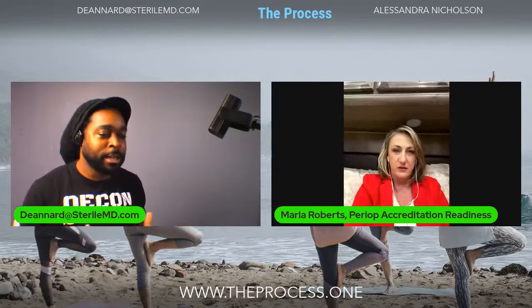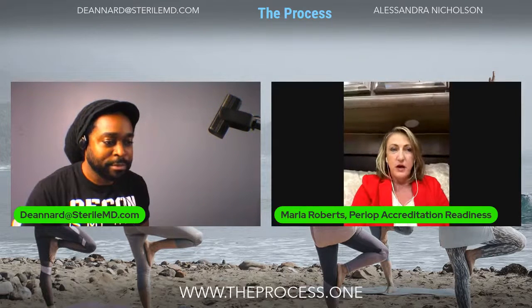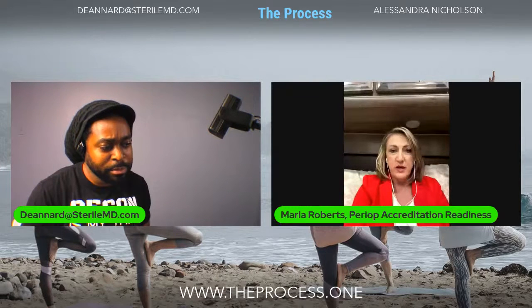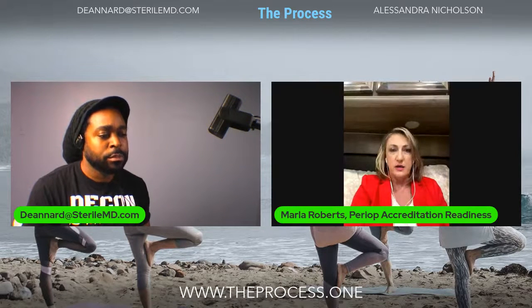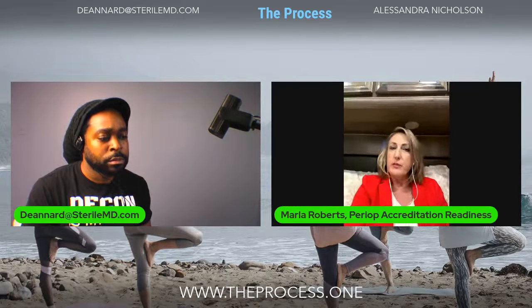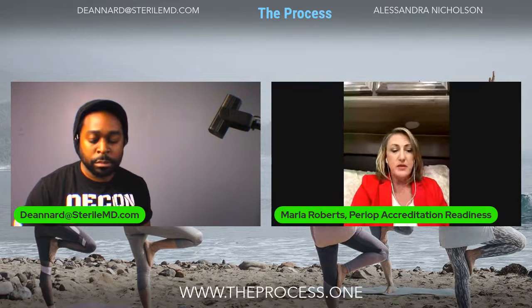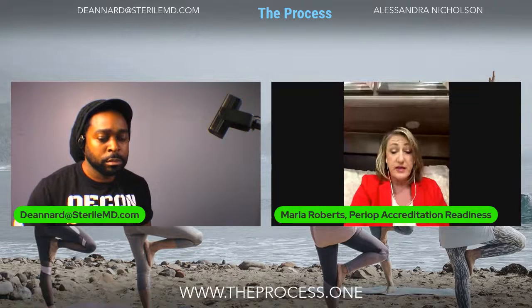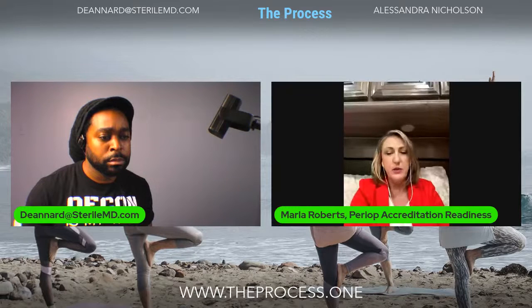How do technicians make a case for buying new equipment when things seem to be working? Okay, and that's one of the things that I wanted to tell you too. You need to make sure that you document when you go into what you can be cited for. Number one, I think that people that work in sterile processing, especially your managers and supervisors, need to understand that when they're requesting equipment, they need to be very specific about what they're requesting and why. Maybe you've gotten the three quotes, if that's up to you to do, or some kind of price range, if you know what it's going to cost to fix it. And you make your case based on this being an infection control issue. Cover yourself, because when it comes back to you, you made the request.